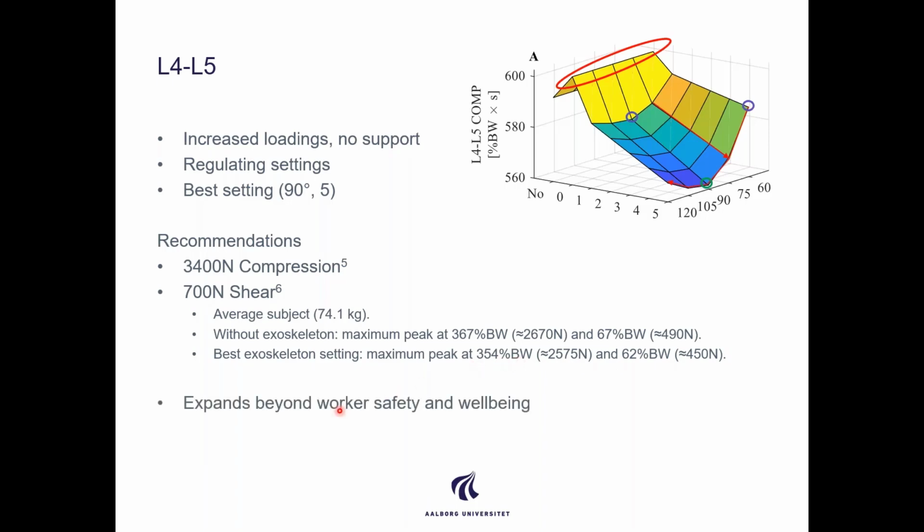However, as I was talking about in the introduction, I told you that some of these exoskeletons had shown increased endurance and productivity. So it expands beyond worker safety and well-being, because if you have a worker who's working without an exoskeleton, he might produce a specific amount of work a day, but when he is performing the task with an exoskeleton, he could actually improve his capacity.